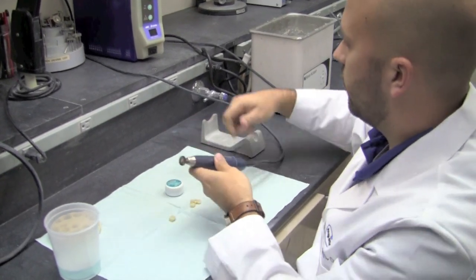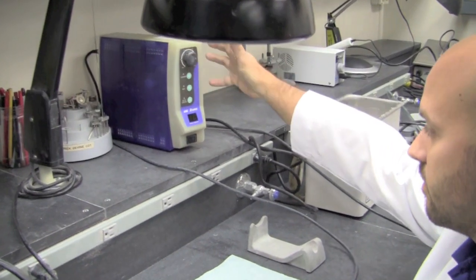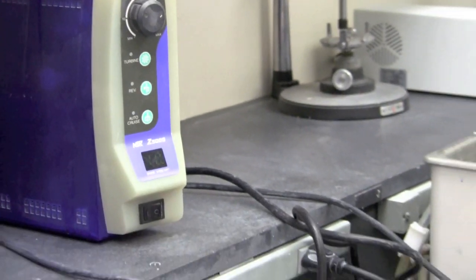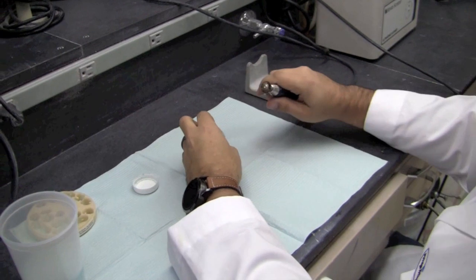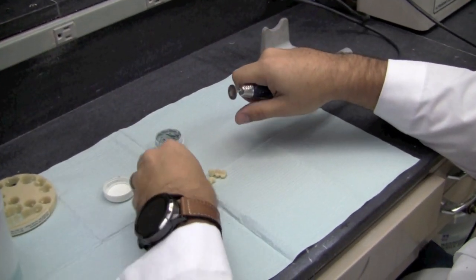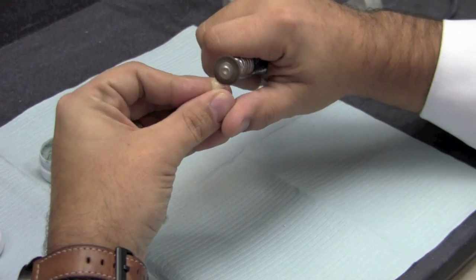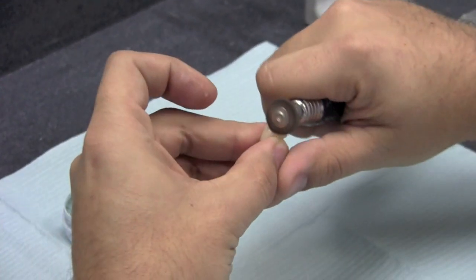First thing you're going to do is set your handpiece to a low speed. I usually set mine on 10, and then I'll go ahead and come in with my handpiece, grab a little bit of the polishing compound, and gently go over it. If you push too hard you could burn the material, so you just want to gently let the handpiece do the work for you.